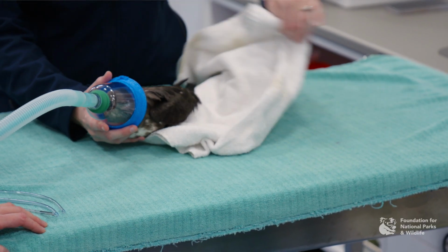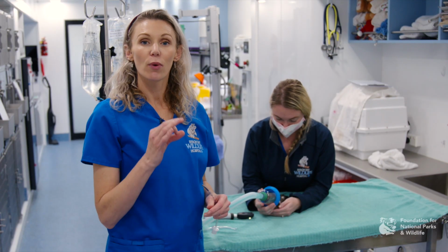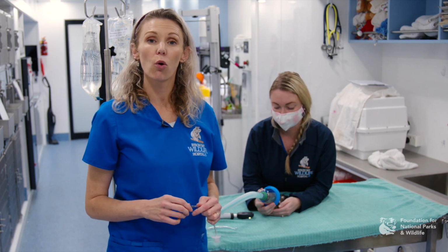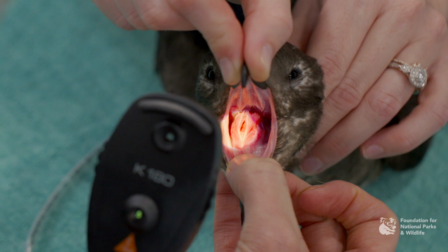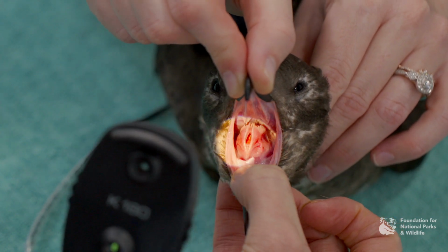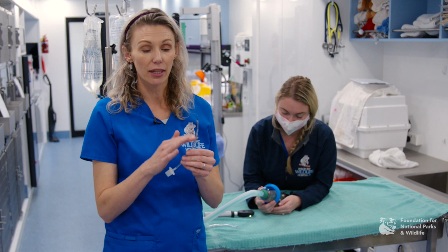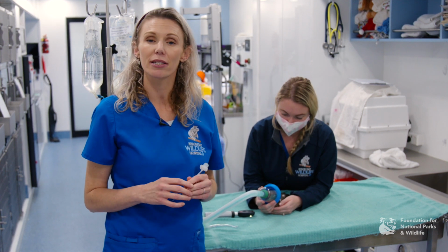If you are going to intubate your seabird, one of the considerations that must be taken into account is when you're looking at the glottis, there is a small cartilaginous projection that comes from the ventral aspect. Now this can get easily irritated and can bleed, so it's important that you choose an uncuffed ET tube of an appropriate size that is not going to irritate that projection. Otherwise, when you do remove it at the end of your procedure, you may have blood within your tube and you may cause irritation and inflammation, which can result in difficulty breathing.